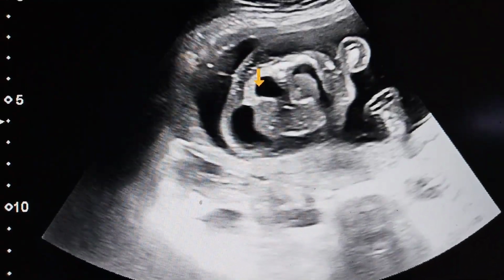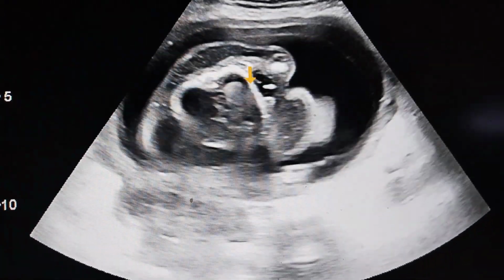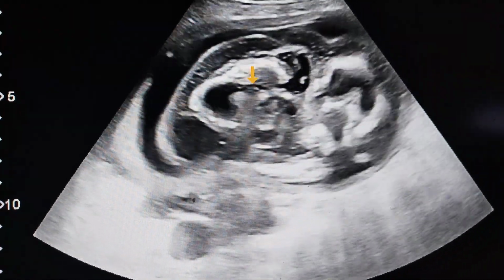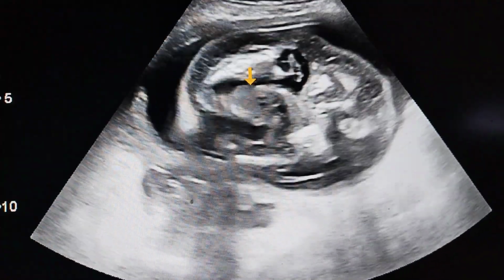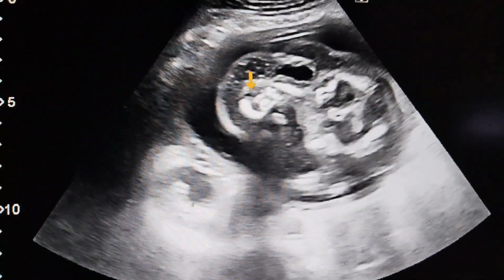So first we look for any infection. Due to the TORCH infection, calcification can occur in the fetal brain. When inflammation is present, there is increased capillary permeability, then this fluid leaks to the subcutaneous tissue and the edema occurs.